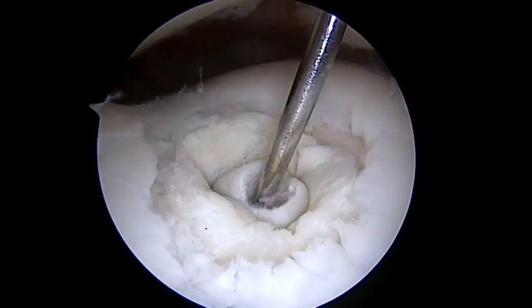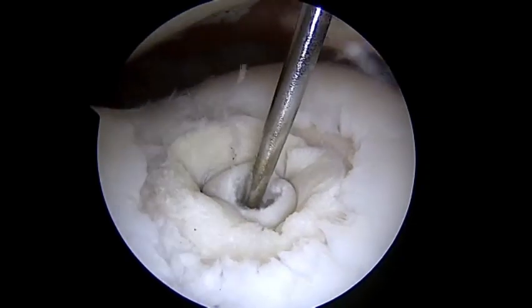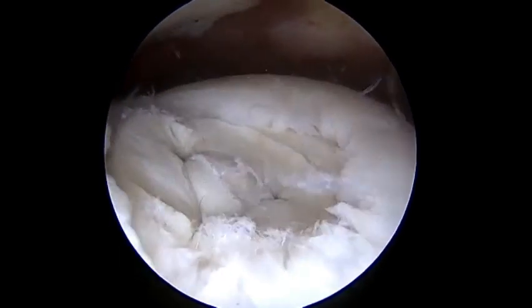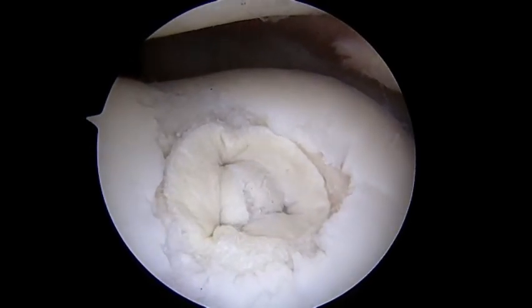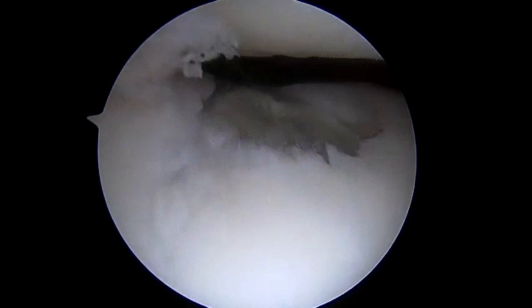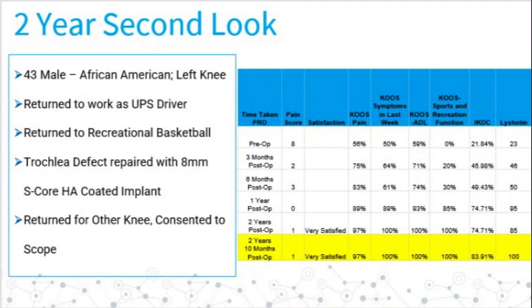This is the guide pin that remains, and you can see the slit within the graft where the driver entered the implant, and then a tamp is used to compress the graft, and in so doing, the slit is somewhat closed, and you can also use the tamp to palpate the surrounding tissue and to be assured that it is at the desired level of repair. The surrounding tissue can also be further debrided.